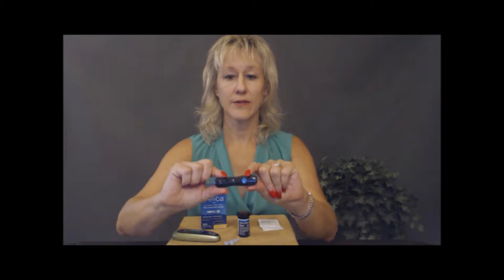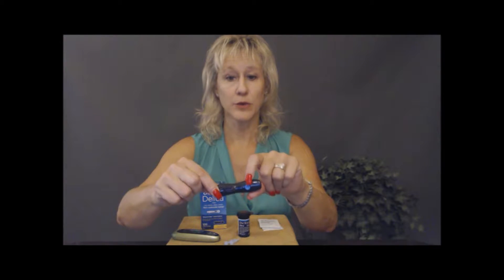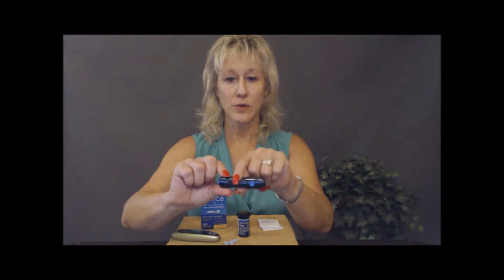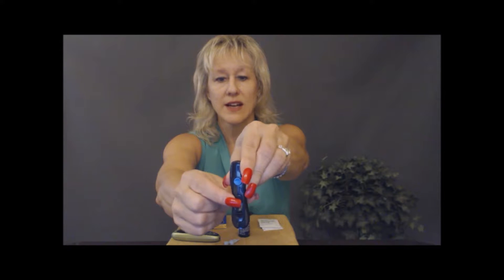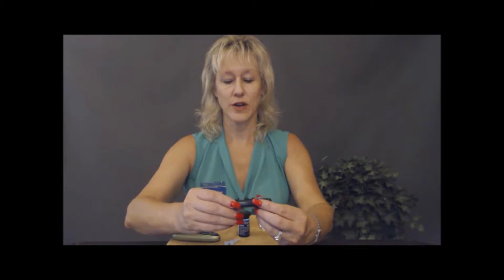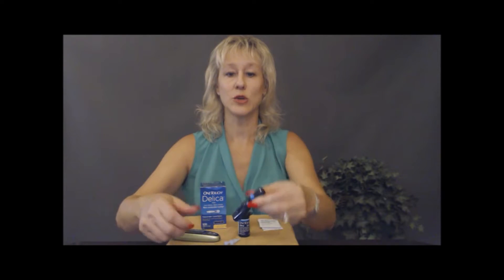Every lancet is going to have similar pieces and parts. You'll have a button of some sort that pushes the needle into your finger. On this one there's a lever that slides down — that's to prime, to get the needle in place before you push the blue button to go into your finger. Then there's another tiny lever that moves in the opposite direction, and that's to eject the needle when you want to change and replace it.